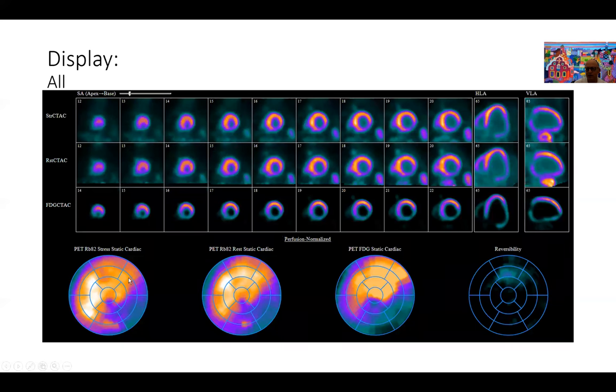This is how we display stress images, rest images, and FDG images on the right hand side here. Almost a matching defect all across. So no viability in this instance, no ischemia, no viability in a fixed scarred lateral wall.